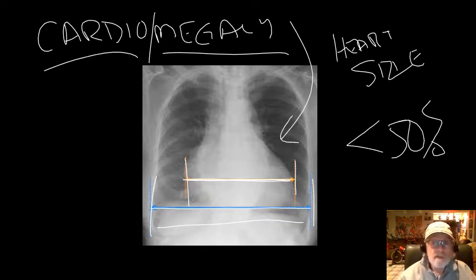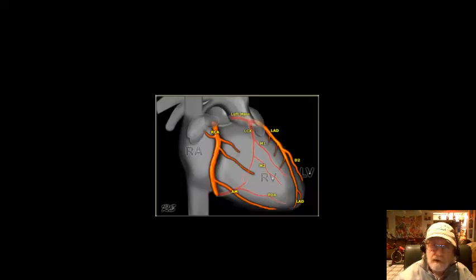Again, some things will change that, for example if it's not a full inspiration film, simply because the diaphragm is going to be higher, changing the heart size or heart location and positioning, as we talked about previously. Okay, a couple of things I just want to mention here, and just to show you some images. Now, this isn't really images, more of a diagram, but I'll show you some images.